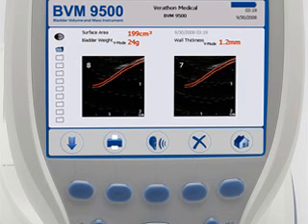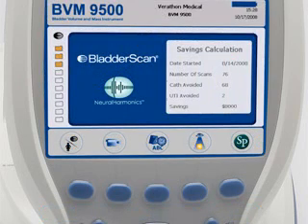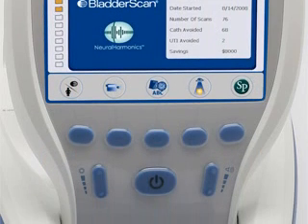If the bladder volume was not between 150 and 400 milliliters, UEBW will be blank. After reviewing exam records, you can return to the home screen and perform another exam. Once you have finished your exam, wipe the ultrasound gel from the probe and turn off the instrument.